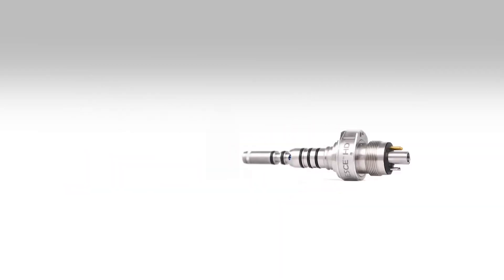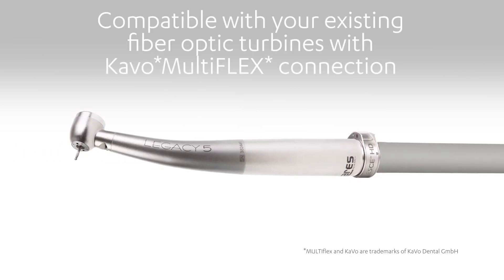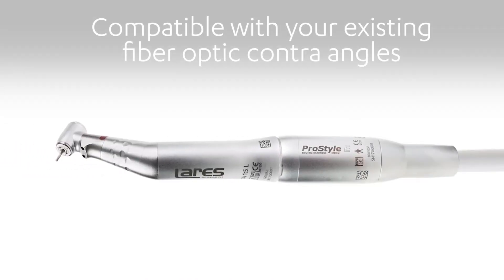Add Floress HD to your existing fibre optic air turbines using our CAVO Multiflex compatible dual wavelength coupler, or simply plug and play with your existing foot pedal and our Floress HD ProStyle E electric handpiece system. Our dual wavelength motor will add Floress HD technology to your existing fibre optic contra-angles.